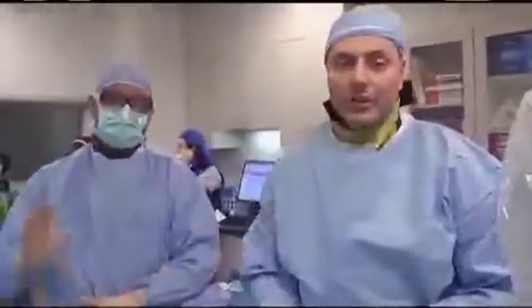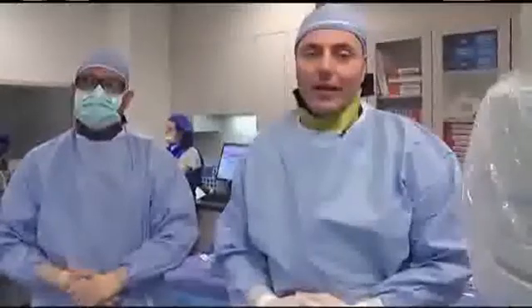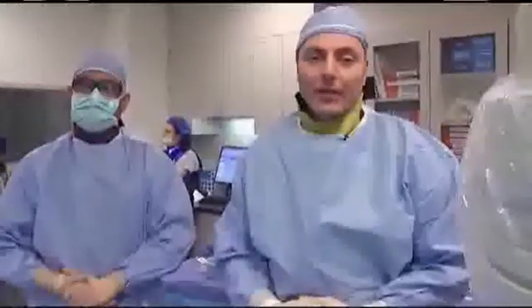My name is Maher Elder, I'm an interventional cardiologist at Detroit Medical Center Cardiovascular Institute. I have next to me Dr. Ahmed Woneer, who is also an interventional cardiologist, and we are planning on doing a complex task D lesion of a complete occlusion of the right common and external iliac.